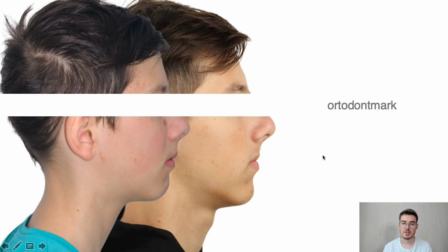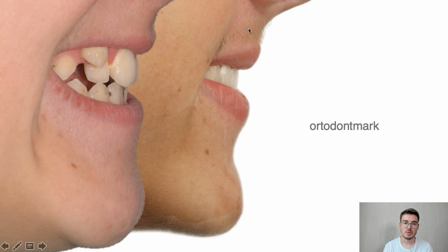Let's evaluate the boy's growth. It is clear that he has grown. In fact, we treated him during the time of his active growth. This is both good and bad because he grew vertically and his bite opened during the treatment. His nose also grew, slightly affecting his upper lip. The incisors remained almost the same, provided there was crowding and a significant lack of space, meaning we did not get a protrusion. The space we need, we got due to expansion. It is also very good.